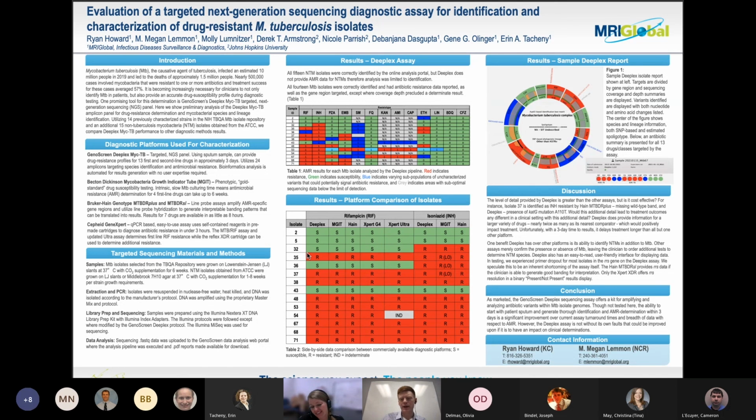But I'll add, it is also, I think, a lot more efficient than a whole genome sequencing, where you're sequencing 4.4 megabases of the genome for each isolate, right? This is targeted, we only want to know these 18 primer regions, and that's it, and we get a lot of depth there, and we can multiplex up to 45 or 48 isolates on a single MiSeq cartridge. So it becomes a lot more cost efficient as well for the information that you are getting.